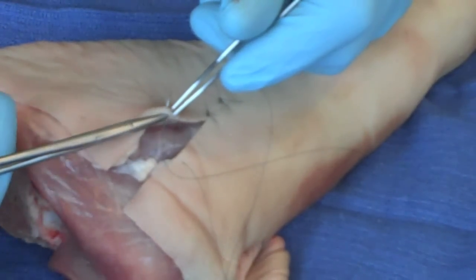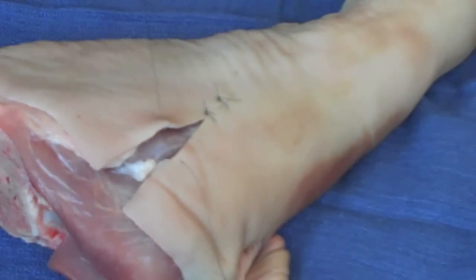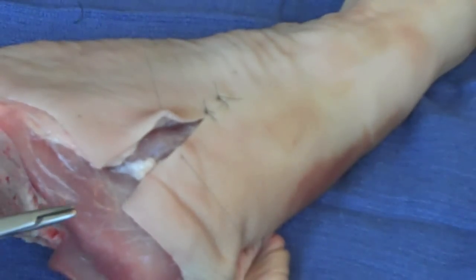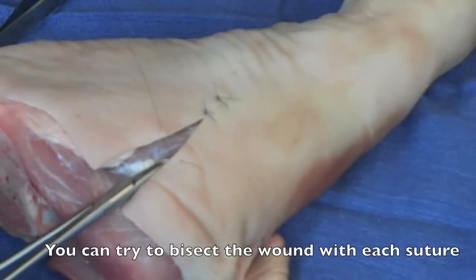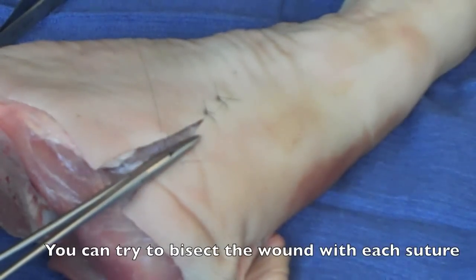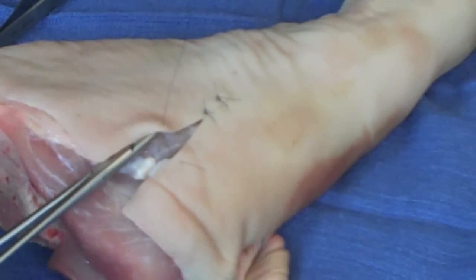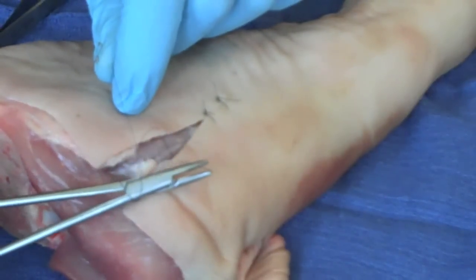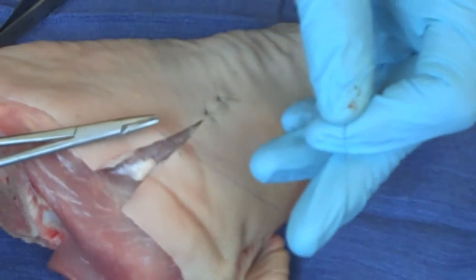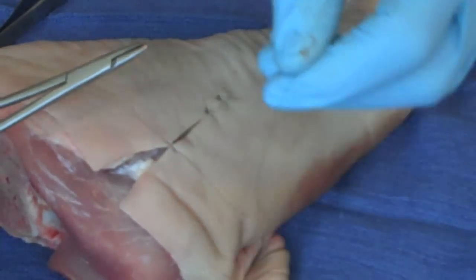I push through the skin and pop through. Then I pull the line, trying not to pull it all the way. Midway down here, what I'm going to do is always divide the wound in half. So I'm going to throw my next suture there — middle of the wound, wrap twice in the first throw. I always start from the middle with the needle driver and go outward. Right there, closes it up nicely.